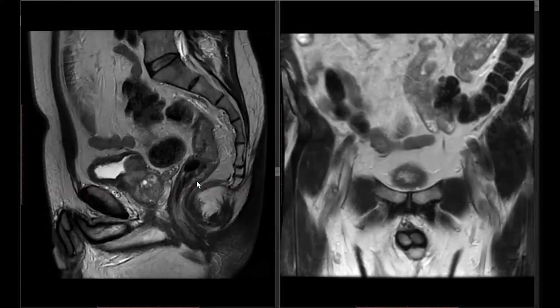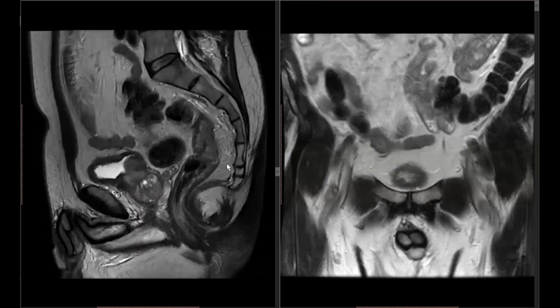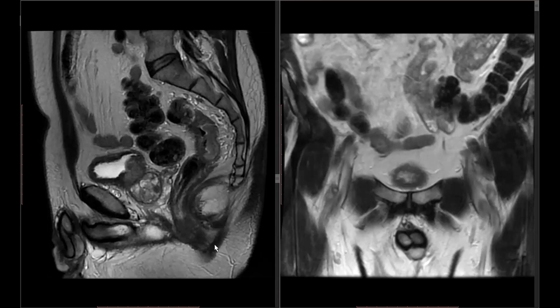The next part we're going to talk about is anatomy. The first question in terms of anatomy is what defines the rectum on an MR. The definition of rectum on an MR is slightly deviant from the traditional anatomic definition in that MR follows the endoscopist perspective of the rectum. The endoscopist considers the rectum to be the most distal part of the GI tract that extends 15 centimeters from the anal verge.